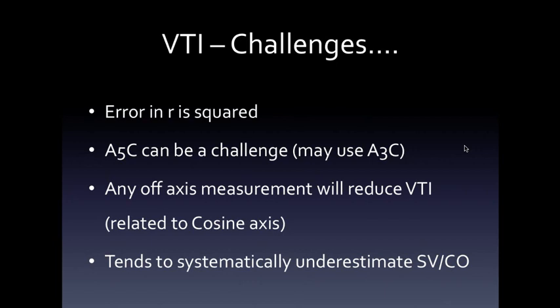And similarly, a lot of these are only ever done when you're asking a question. So I would advise people not to use this technique unless you do it in a lot of normals. And people might have their own feelings on it and use this in the room all the time, but I tend to be cautious in interpreting it.